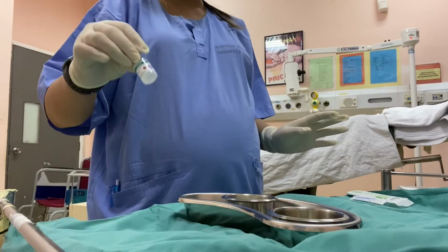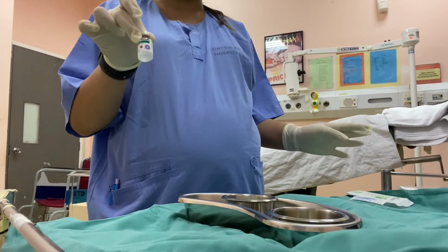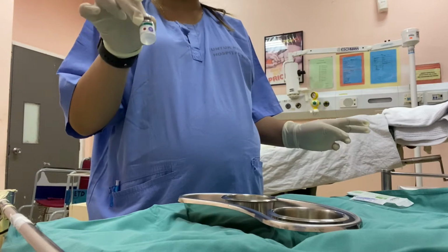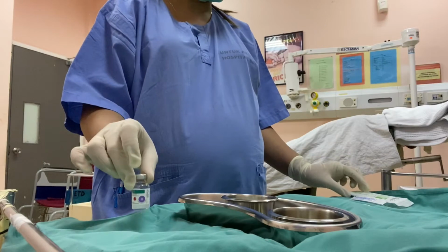These are the medication that we are prescribing or administering to the patient, which is given through IM injection. This is the ATT injection.